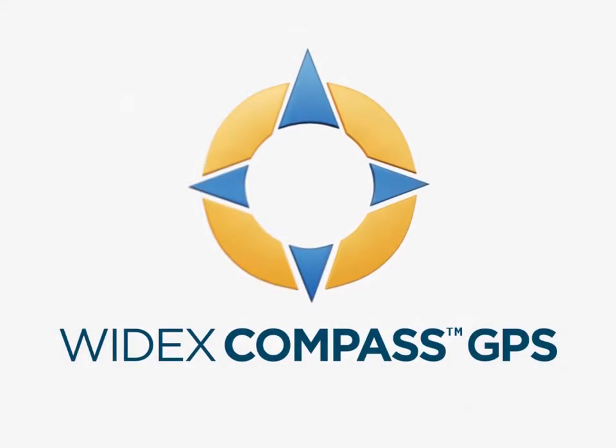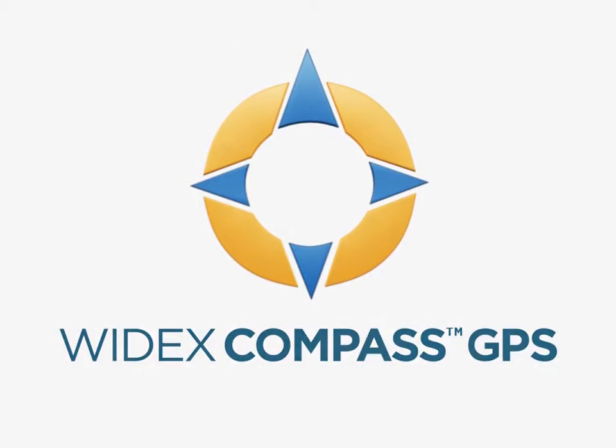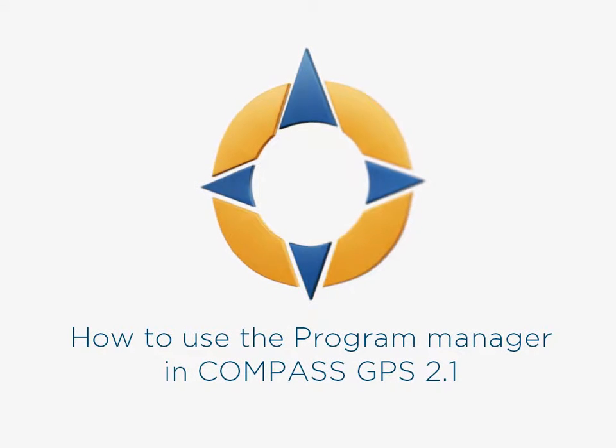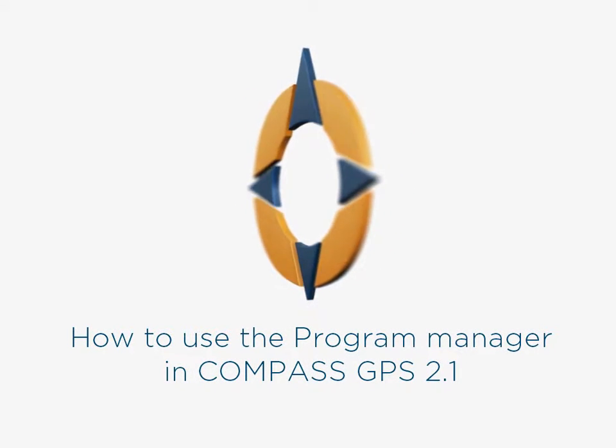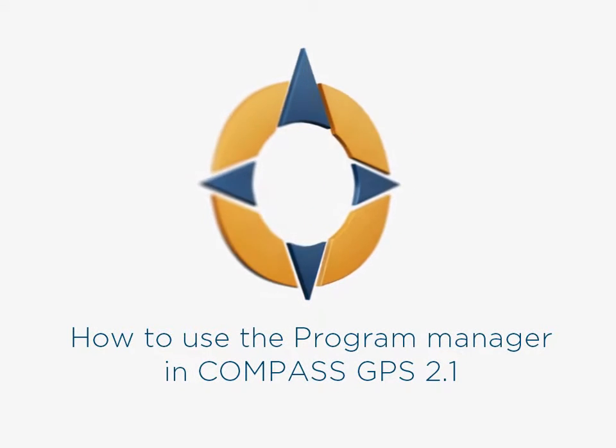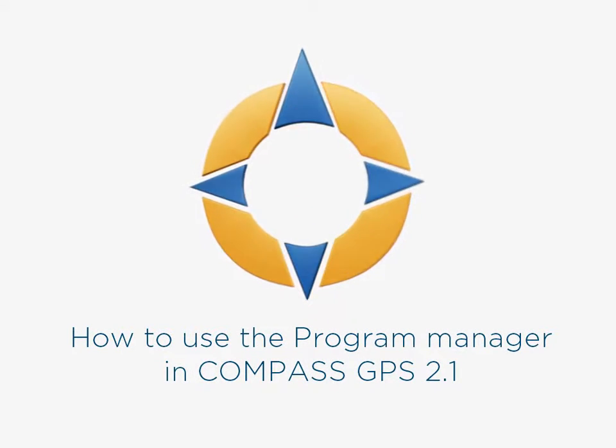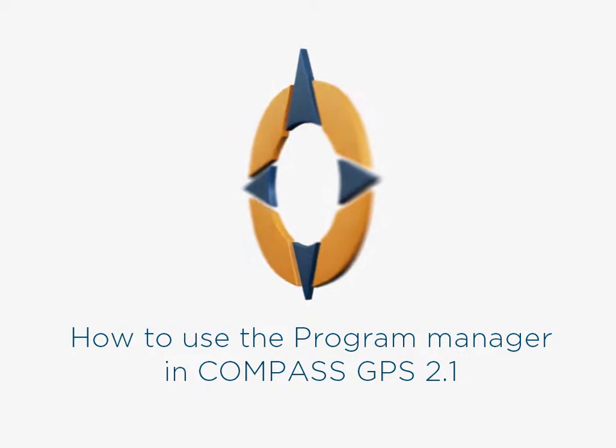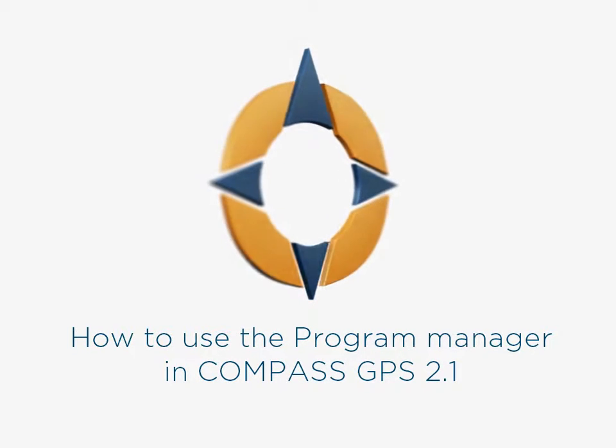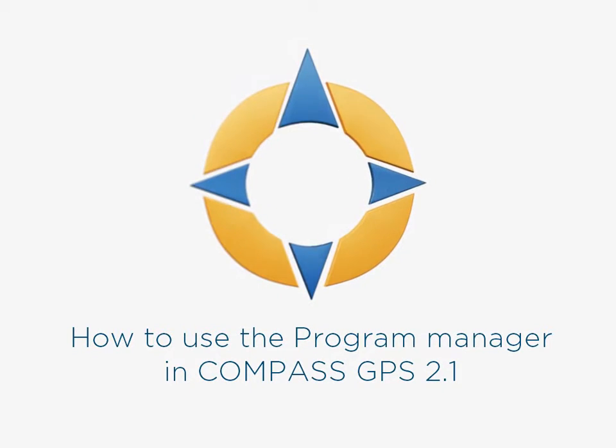Welcome to this Widex eLearning tutorial on using the Program Manager in Compass GPS 2.1. You can use the Program Manager to add programs to the hearing aids and to manage the chosen programs.